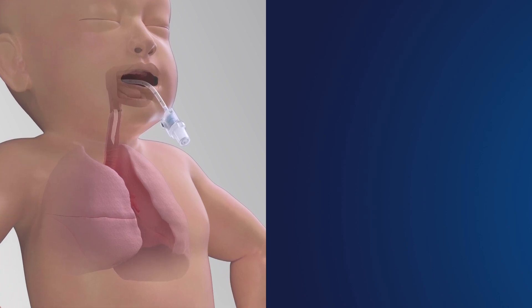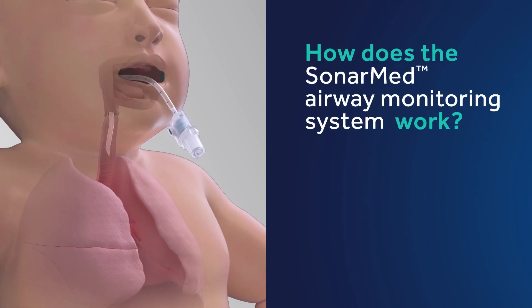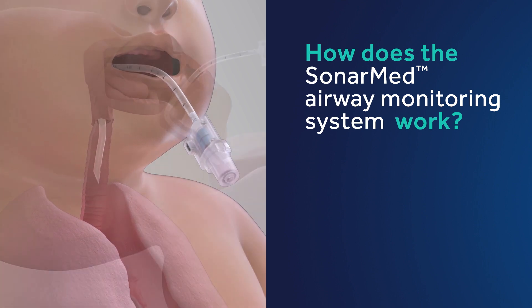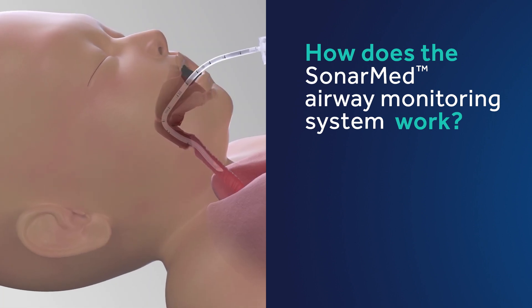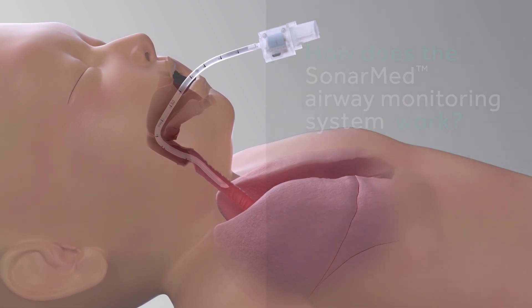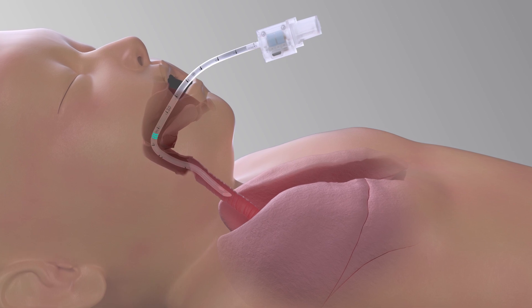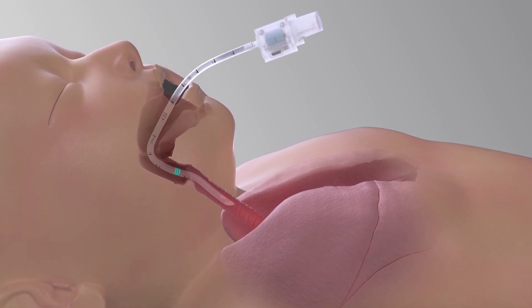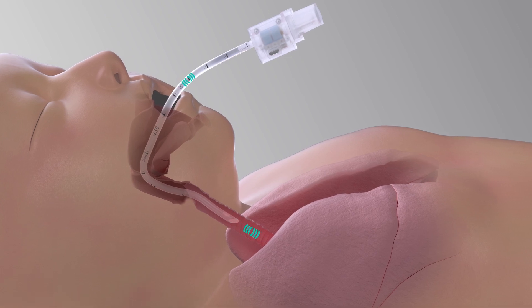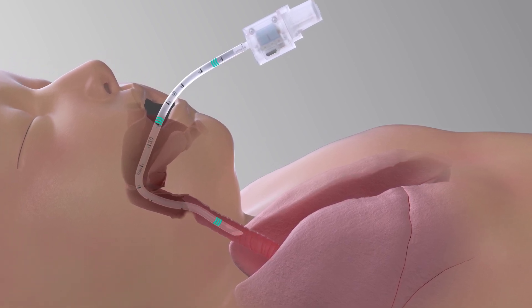How does this device work and what data will you see on your screen? This unique device uses acoustic reflectometry technology to monitor the set optimal position of the ETT in the trachea. The SonarMed sensor emits sound waves through the tube and then measures the intensities and timing of the echoes as they return, allowing us to detect several key measures.